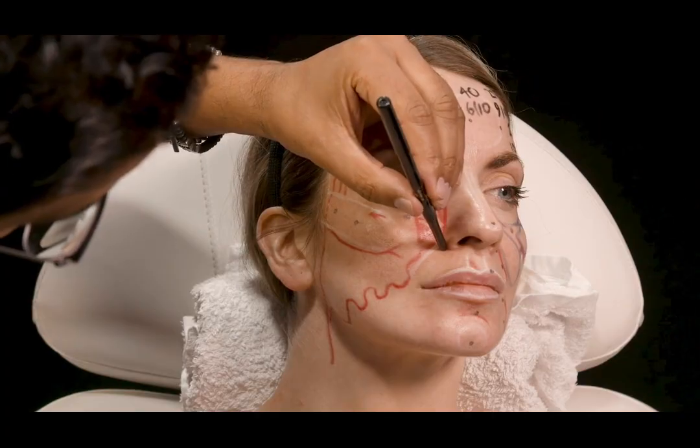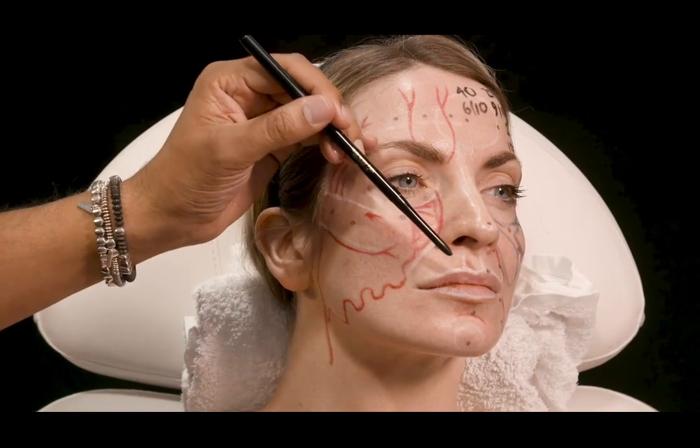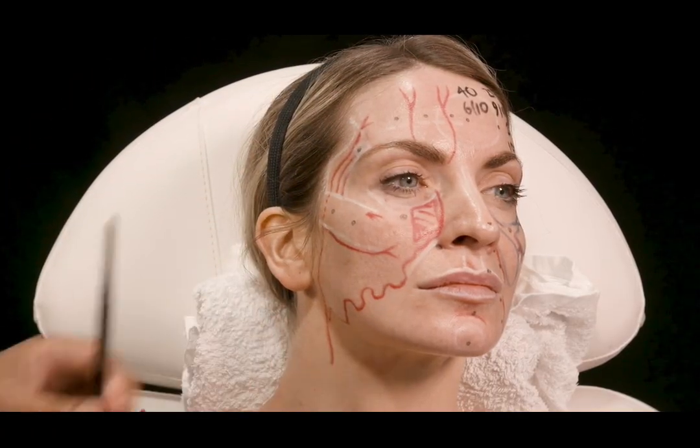So therefore, we are going to inject Lizzie medial to the ligament, onto the bone, injecting perpendicularly away from the artery so as not to follow the artery, because if we follow the artery like this, you've got a much higher chance of being inside it.